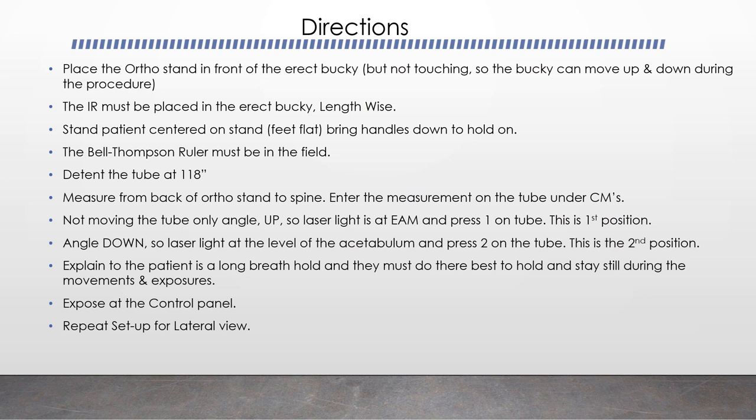Directions. Now these are specific to this device. Place the ortho stand in front of the erect bucky, but not touching, so the bucky can be moved up and down during the procedure. The IR must be placed in the erect bucky lengthwise. Stand the patient centered on the stand, feet flat, and bring handles down to hold on to. You do not want this patient to move. The Bell-Thompson ruler must be within the field.